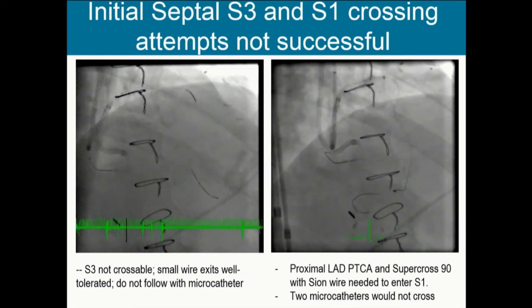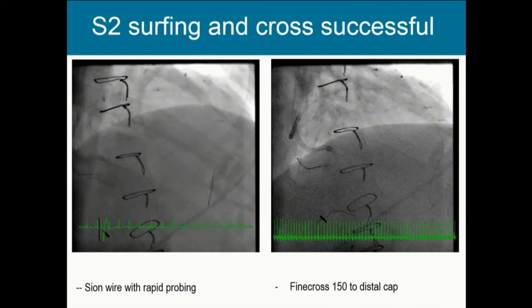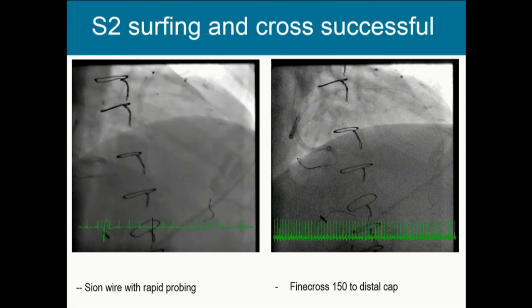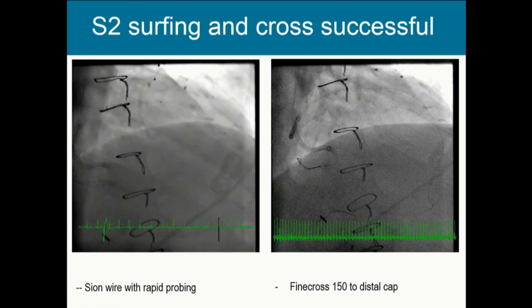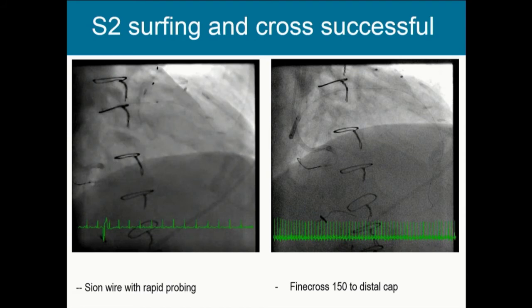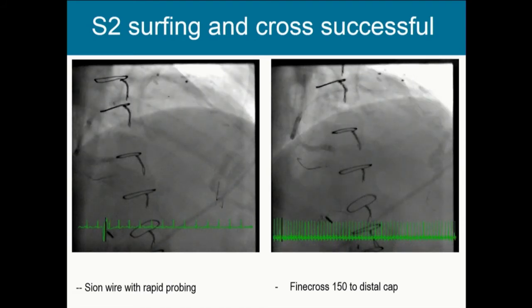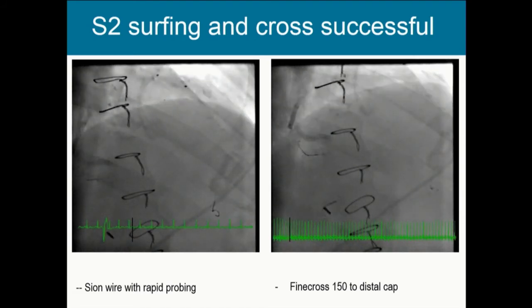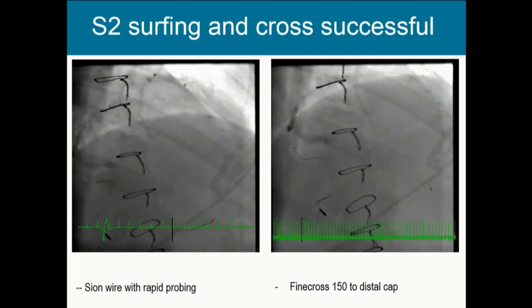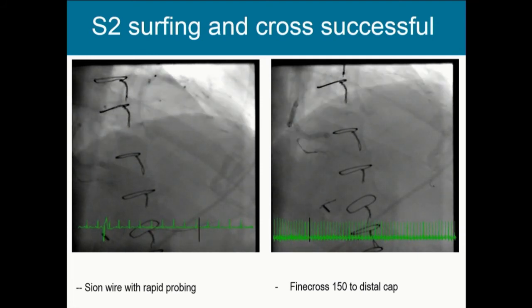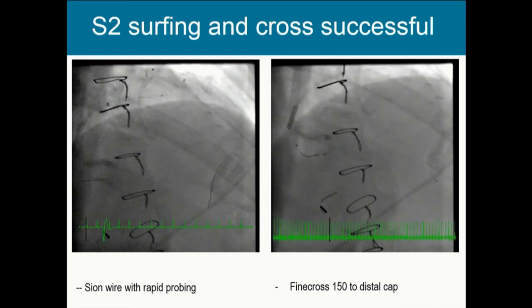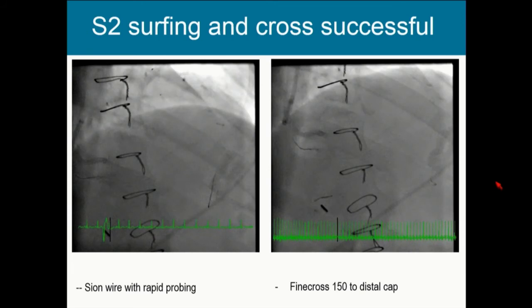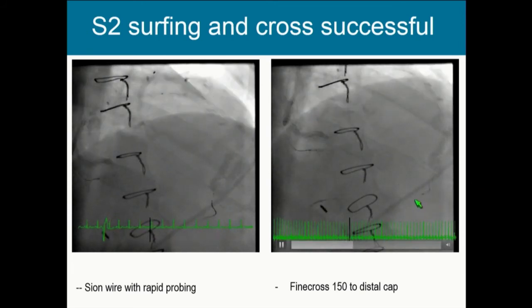We went back to our second septal. Using the techniques described — just gentle, steady manipulation of the Sion wire — this one, which was unexpected, actually crossed quite smoothly. This was confirmed in the LAO cranial view. It just reinforces that you won't necessarily know what your best connection is ahead of time. A Finecross 150 catheter was now able to make it all the way down to the distal cap, and we were now at the next stage of attacking the distal cap and heading retrograde.